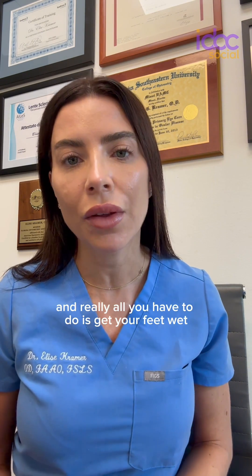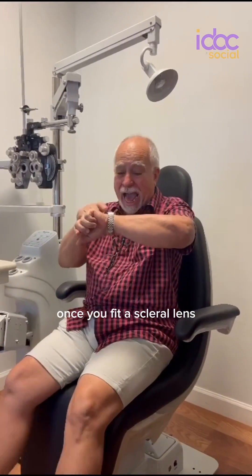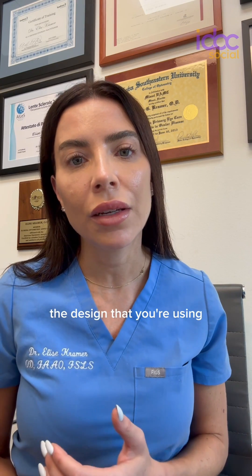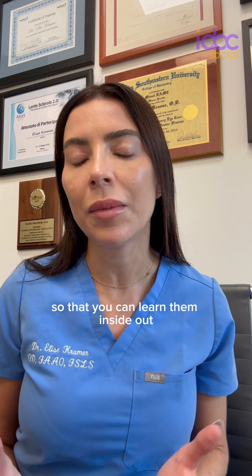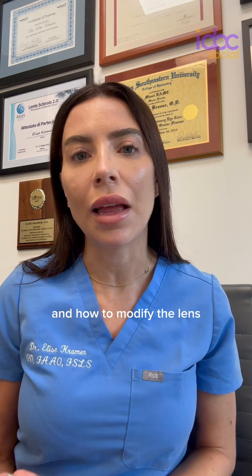Really all you have to do is get your feet wet and you will feel more and more comfortable. Once you fit a scleral lens, you'll learn the ins and outs of the design you're using. I recommend sticking to one specific design or two designs so that you can learn them inside out. The consultants will help walk you through the design — the edge, landing zone, optic zone — and how to modify the lens to get the results you're looking for.